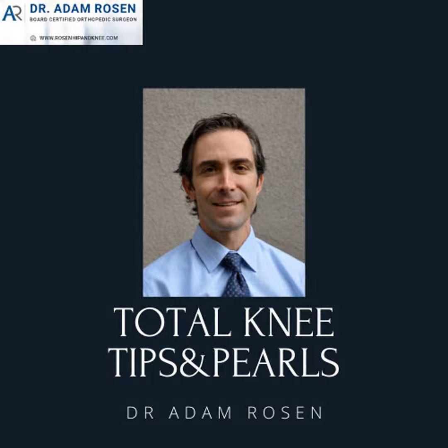So obviously, if they have a cruciate retaining or cruciate substituting insert, this is usually quite easy. Just basically get your tool from your company, or what most commonly is easiest is just using an osteotome and knocking that polyethylene insert out. You want to be aware with old implants, do they have a special tab that went in, or some of the newer implants that have screws? You want to be aware of what implant you're dealing with, because you may need a particular screwdriver to get the screw out, or a tab may have to come out. But if the locking mechanism is built in, you can just knock that out.